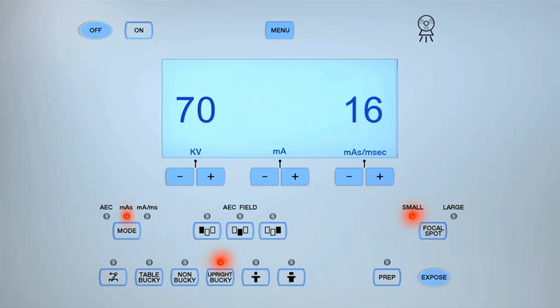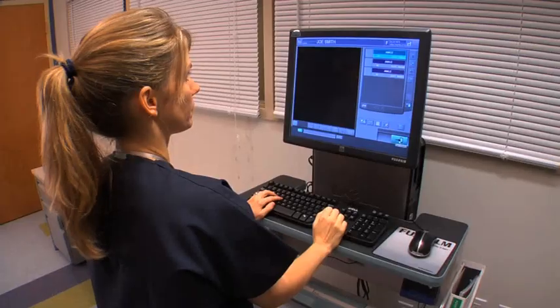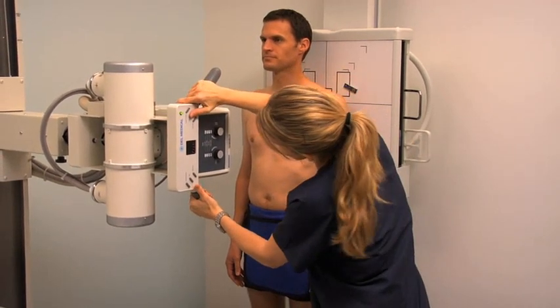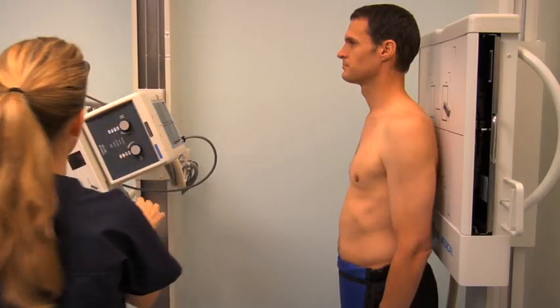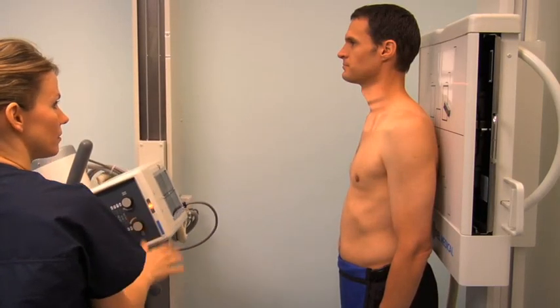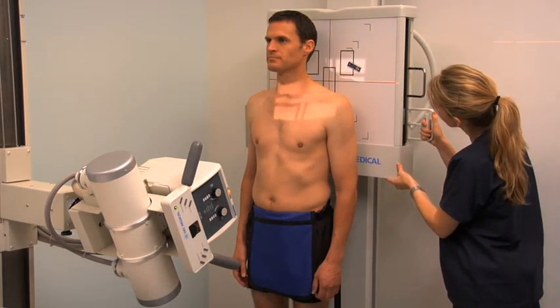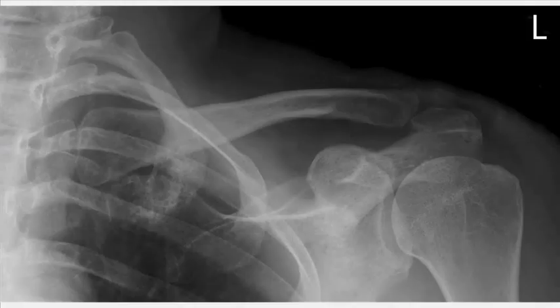Move behind the lead barrier and check the exposure factors, making any necessary adjustments appropriate for the patient's age and body habitus. Ask the patient to hold their breath and keep still. Expose the cassette and ask the patient to relax and breathe normally. Process the cassette while preparing for the next projection. For an AP axial projection, angle the central ray 15 to 30 degrees towards the patient's head, centered over the mid-shaft of the clavicle. Check that the patient is in the same position as for the AP clavicle projection. Move the upright bucky upwards to align the central ray, expose the cassette, and review all images.